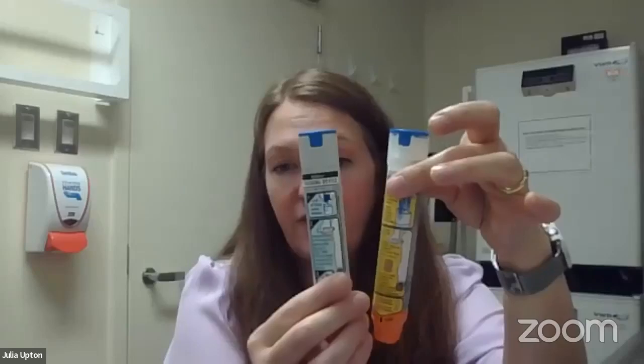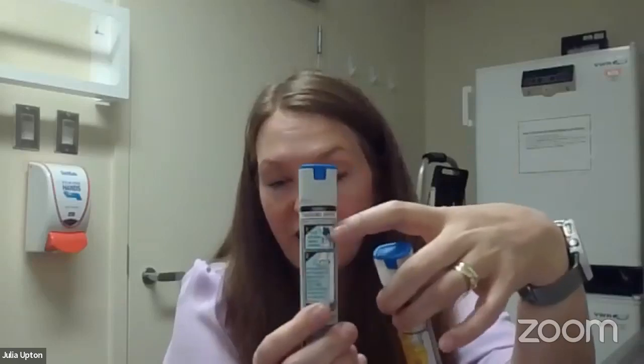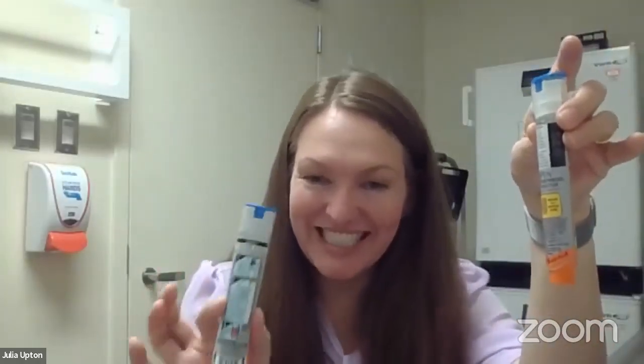And they're very different in color. So the demonstrator is very plain in color, and it also says right on it, training device. So there are certainly differences when you look at them. But it's always good if you're practicing to really make sure, is this the demo, and just have a look and make sure that it's the one with the plain coloring and that it actually says training device right on it.